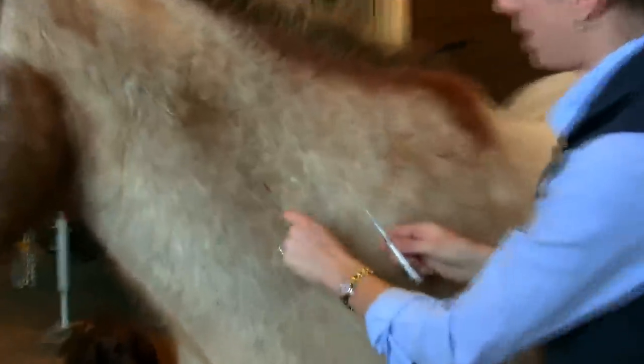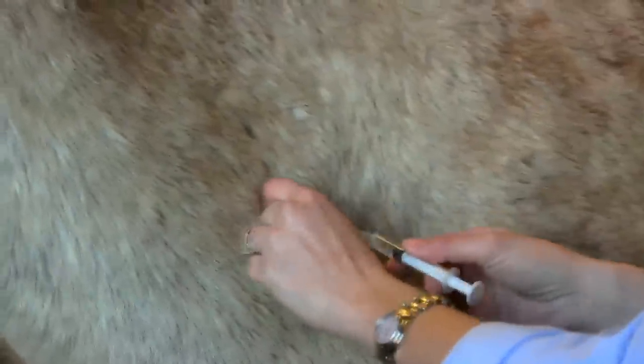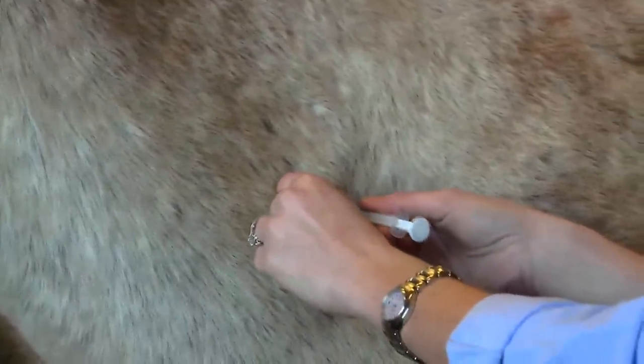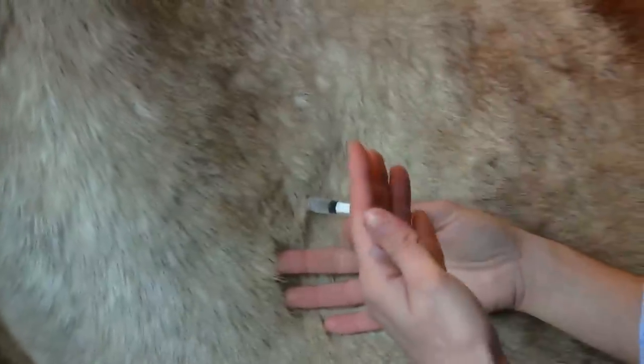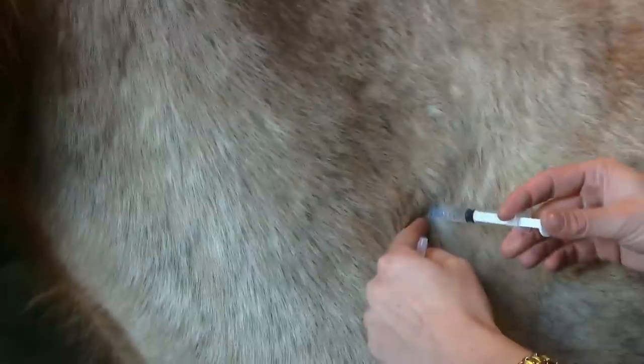What I do is usually just kind of pinch the skin a little bit to numb it up and desensitize it, and I sink that needle — it's an inch and a half needle — all the way in, because I want it to go all the way into the muscle, not just under the skin. Any time you give a vaccine or any injection, you want to pull the plunger back and make sure you see no blood in the hub of that needle, because vaccines and penicillin cannot go into the vein. If you get blood back and give it, it might go straight to the brain or cause a reaction. We do not see any blood, so it's safe to give.